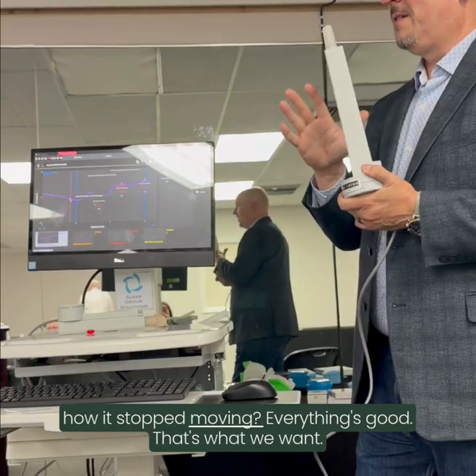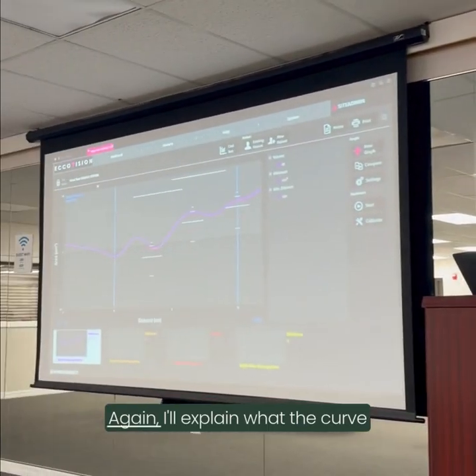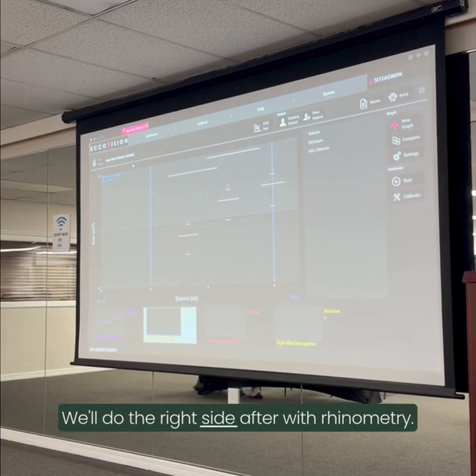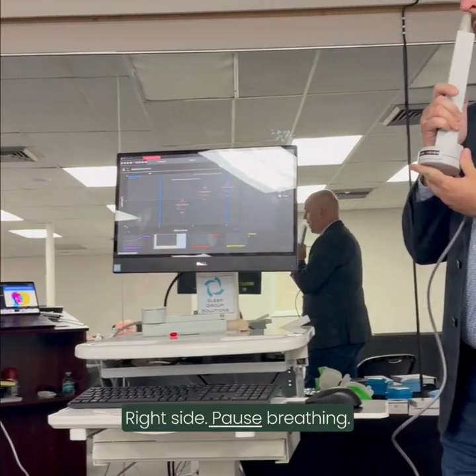See how it stopped moving? Everything's good. That's what we want. Again, I'll explain what the curve means and all that stuff in a second. We're going to do the next side. We'll do the right side after with rhinometry. So we just twist the nose tip around. Same thing, right side. Pause breathing.